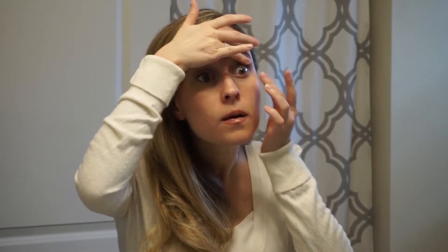Step 5: Hold your upper eyelid with your alternate hand to prevent blinking. Step 6: Use the hand you're putting in your contact lenses with to pull down your lower eyelid.